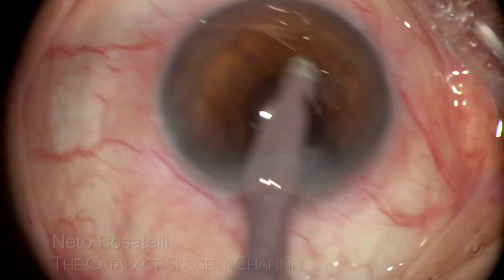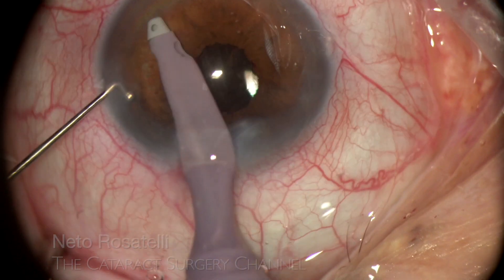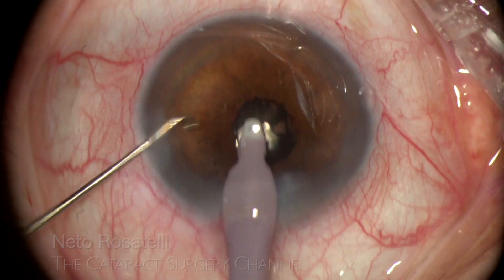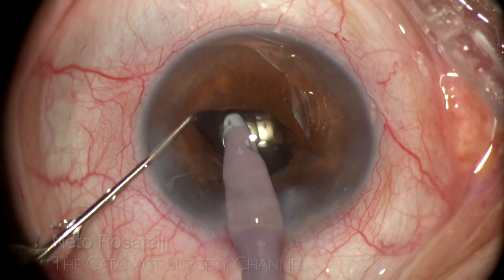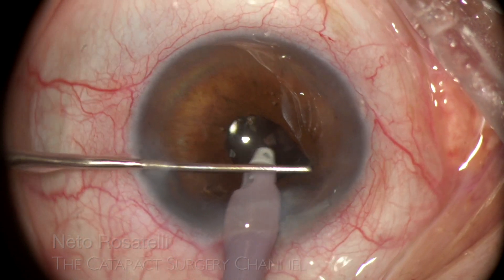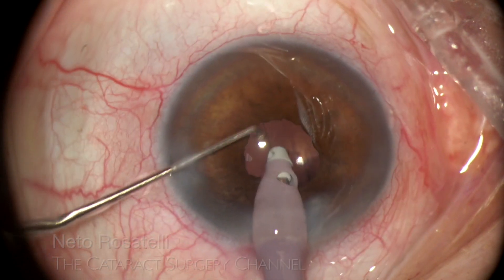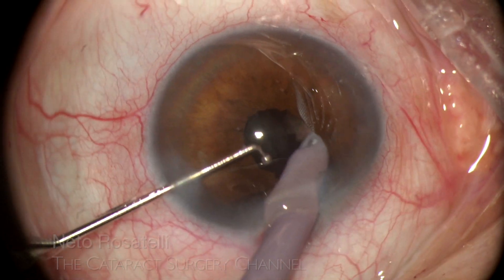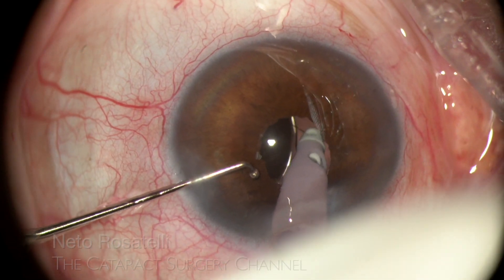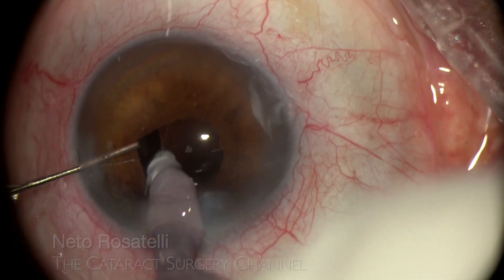OVD evacuation is in order now, and the best way to do it is in a methodical fashion to be sure of complete aspiration. The chopper helps, of course, preventing pupil margin aspiration and providing visualization. Lifting the iris is necessary to ensure OVD evacuation from the peripheral space between the iris and the capsular bag — in other words, the posterior chamber. We must also perform under-the-IOL aspiration: a little clumsy to do, but necessary. Let's go for the other side of the bag also.